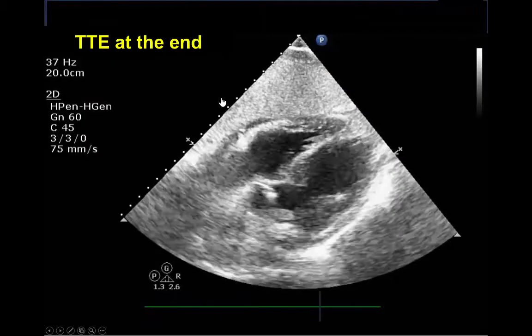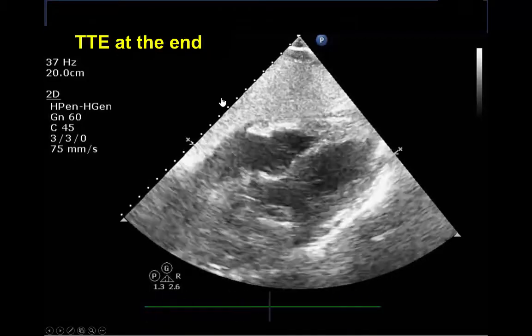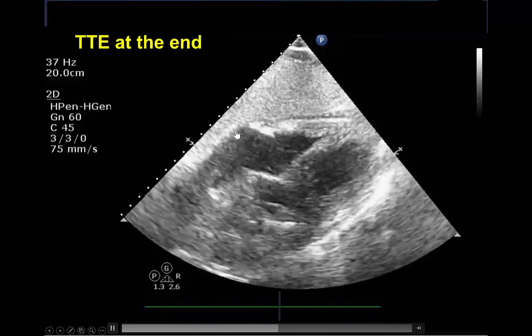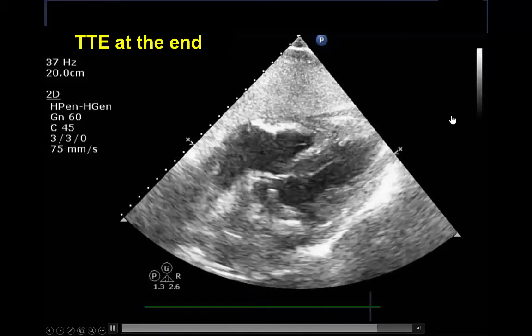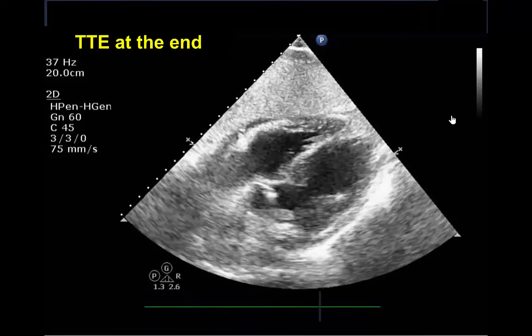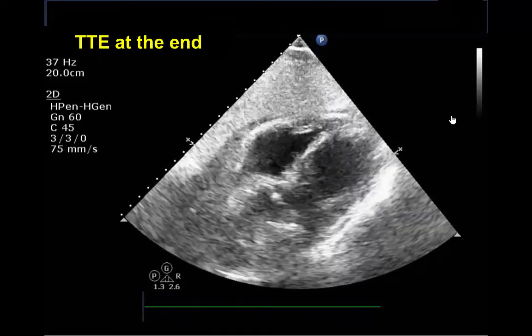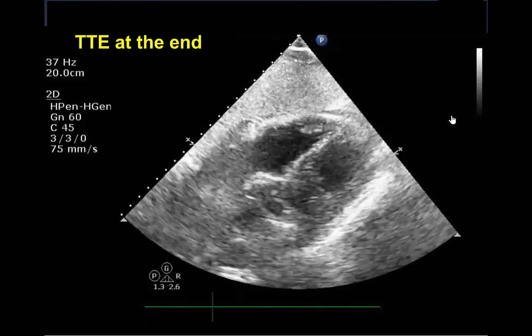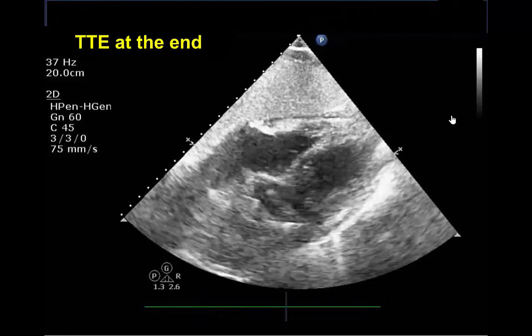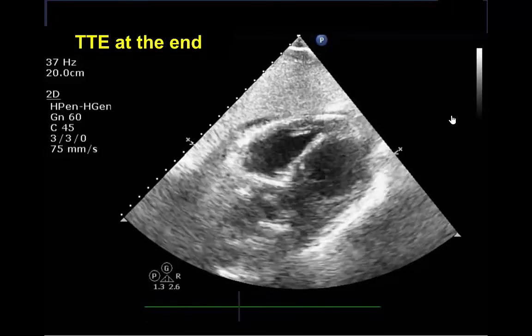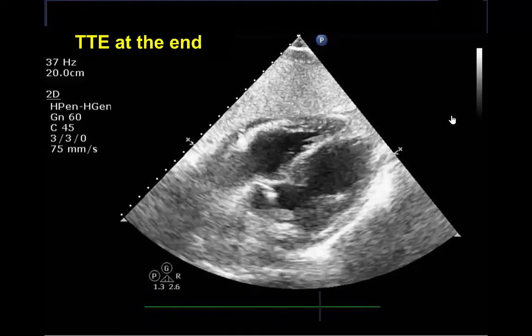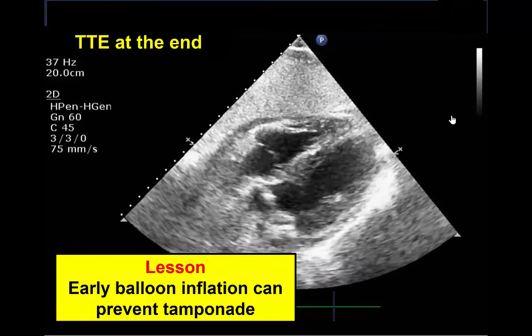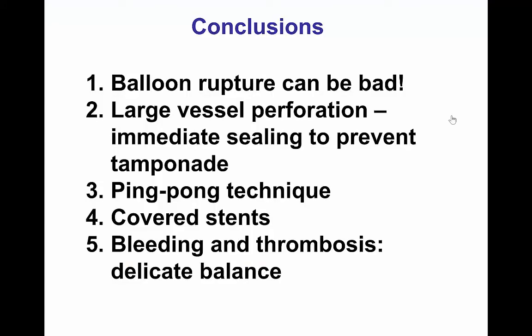The patient did very well. He did not have any hypotension, and a repeat echocardiogram done at the end of the case showed only a very, very small pericardial effusion. As a result, we did not perform pericardiocentesis. This demonstrates the importance of inflating a balloon immediately after a perforation occurs, because by doing that — and using the dual guide catheter technique — we can minimize bleeding into the pericardium and avoid the need for pericardiocentesis. Early balloon inflation is key. The patient had an uneventful recovery.